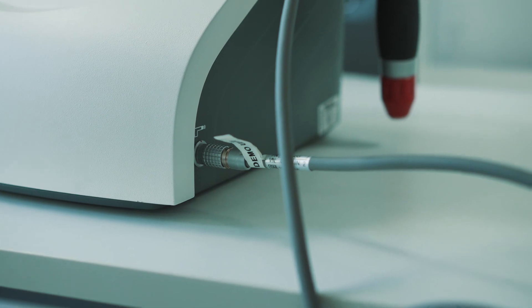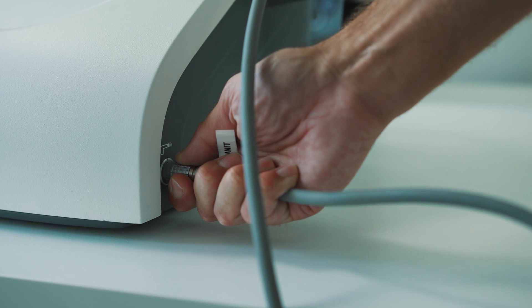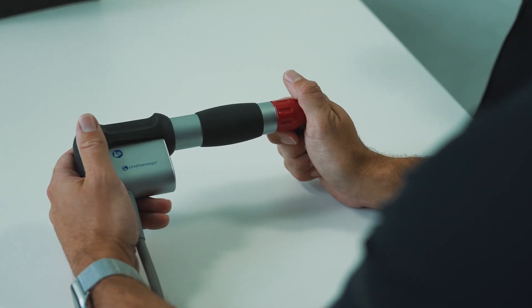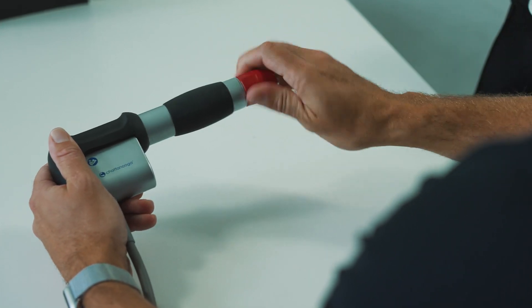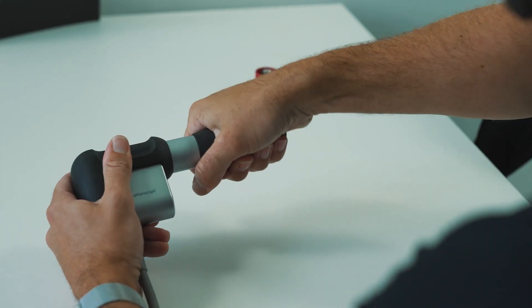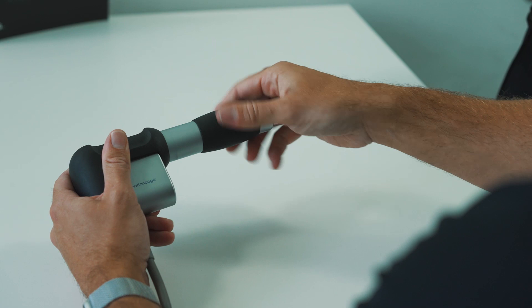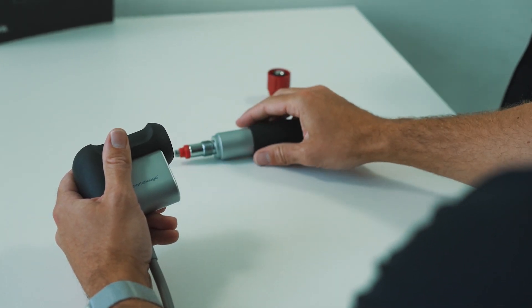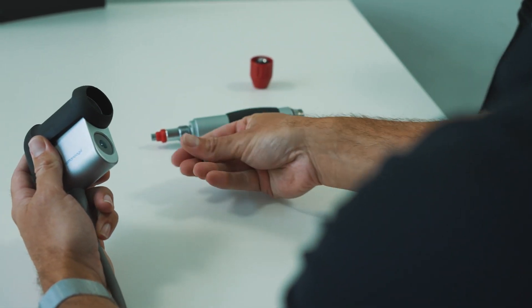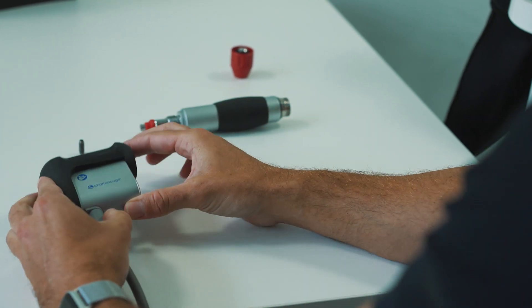The first thing to do is to ensure that your device is switched off. We're then going to remove the handpiece — pull back on the connection and then remove gently. Now that we've disconnected the handpiece, we're going to remove the transmitter, which just unscrews by hand. Place this safely to one side. Next, unscrew the barrel, place it down on the table, remove the projectile by tapping it into your palm, and place that somewhere safe.